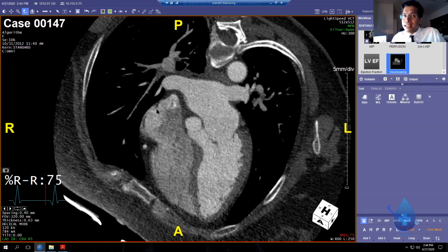The crista terminalis has been cut out and placed in a pan in the operating room because the CT imagers called it a myxoma or a tumor. I've been called to the operating room probably 3 times in 15 years, and a surgeon pissed off will call me and say, look in the pan, what do you think that is? I'm like, I don't know. He's like, that's the normal crista terminalis that was called a small myxoma or a right atrial tumor or something. So recognize that that is a normal structure in the back of the right atrium.